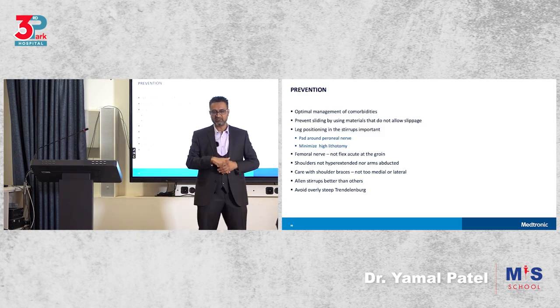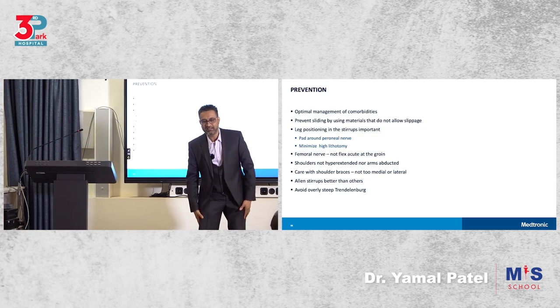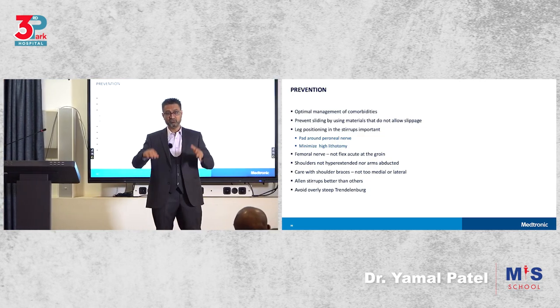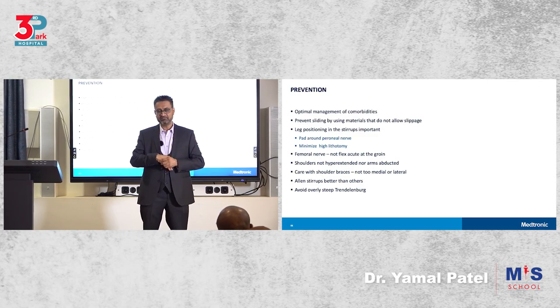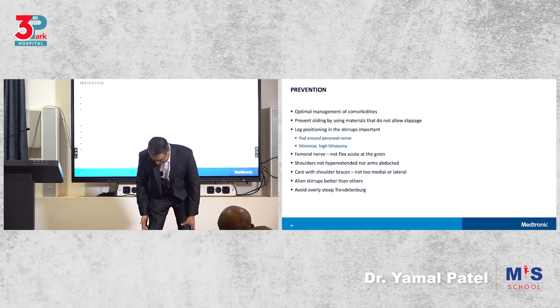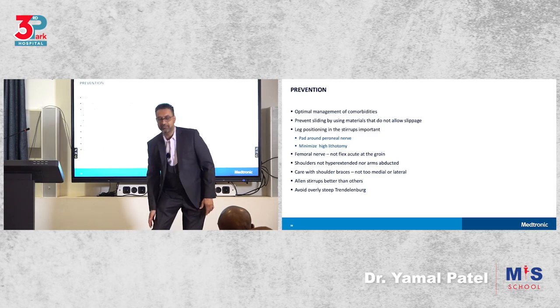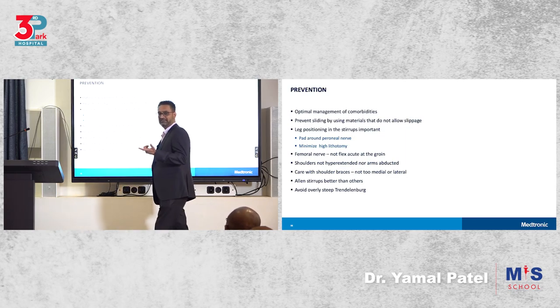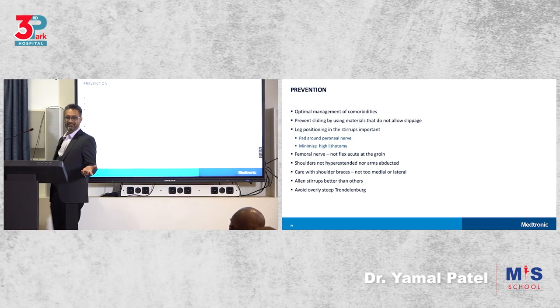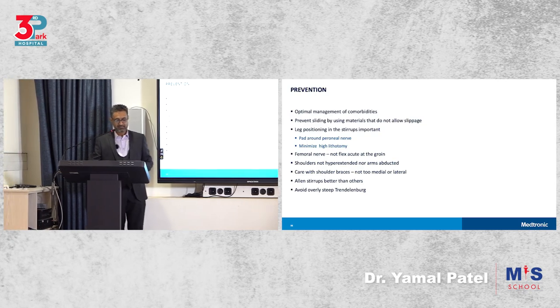Leg positioning in stirrups, have a padding around the peroneal nerve, but with the new Allen stirrups, etc., you may not need to have padding because they're already padded. But if you have those old types, candy cane or those other knee stirrups, make sure you support this area. If you press this for too long, when they wake up, they'll have a foot drop, okay? And you'll not understand why they've had a foot drop when I've done nothing in the leg, but it's your positioning.